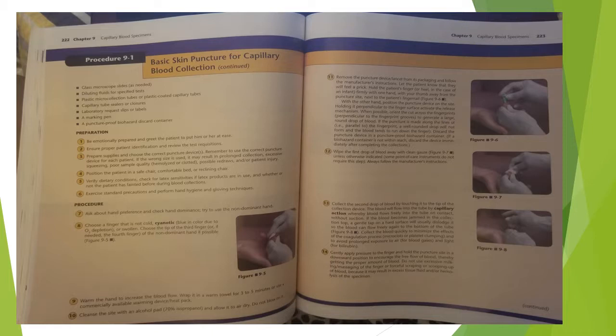Procedure: ask about hand preference and check hand dominance. Try to use the non-dominant hand. Choose a finger that is not cold, cyanotic, or swollen. Choose the tip of the third finger, or if needed, the fourth finger of the non-dominant hand if possible. Warm the hand to increase blood flow.